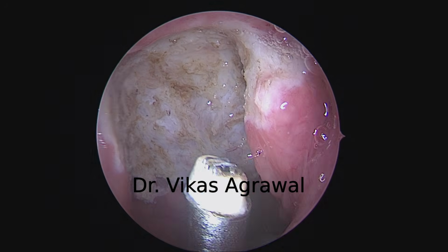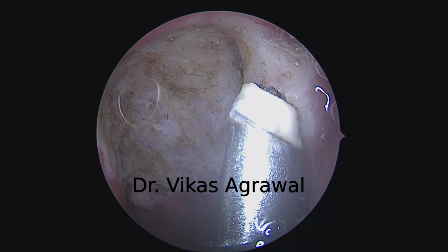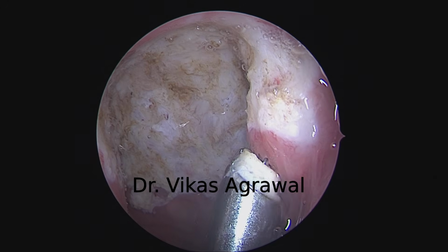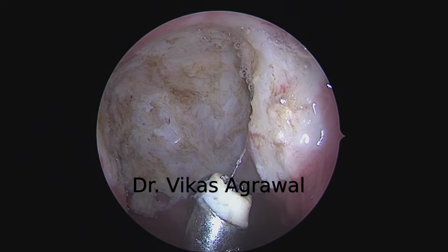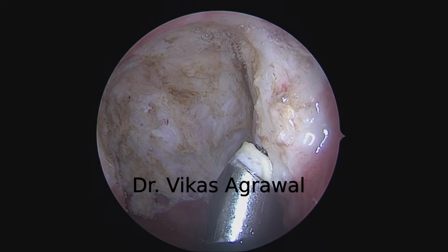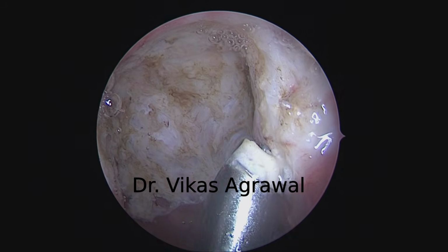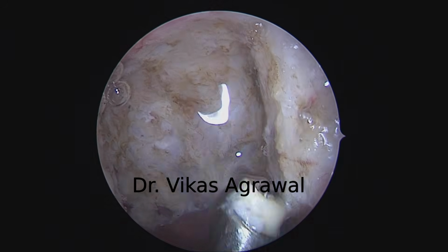If there's a little bit of lymphoid tissue, you can simply coagulate. The last layer you can simply coagulate, if you do not want to take any chance. Now there is absolutely no question of a regrowth, so there is no live lymphoid tissue left. A 1 or 2 millimeter layer can always be coagulated.